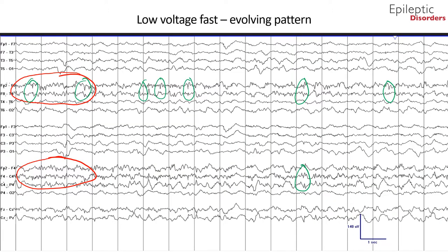The third page of this seizure shown in bipolar montage represents further evolution of the right frontal seizure, with initial low-voltage fast activity seen in previous pages evolving to more polymorphic sharply contoured delta activity at the beginning of this epoch, which then evolves into higher-amplitude quasi-rhythmic delta activity with embedded sharp waves outlined by the green circles.